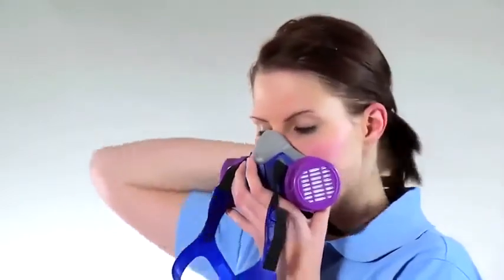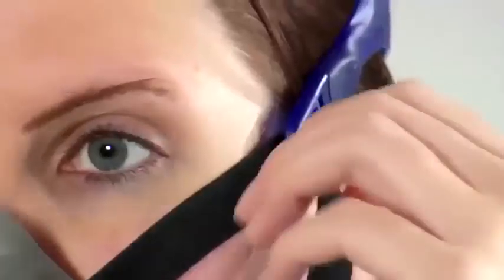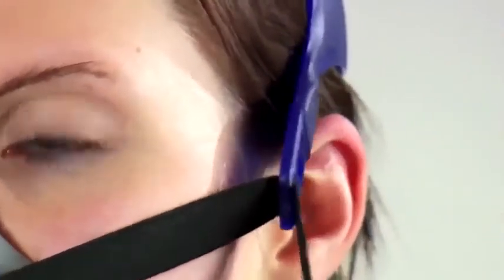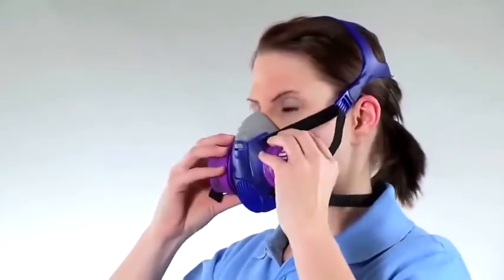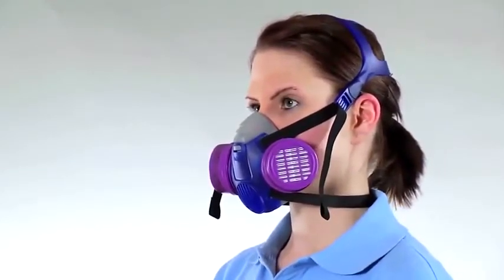Position the face piece over your mouth and nose and pull the head cradle over the head, resting on the crown. Pull both straps forward uniformly until the face piece fits securely and comfortably against your face.